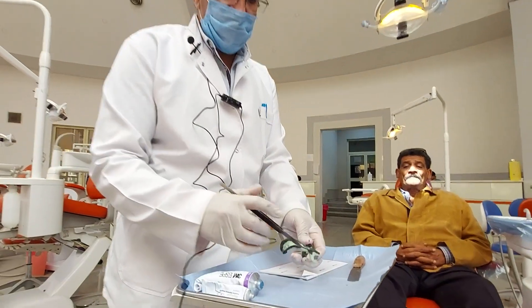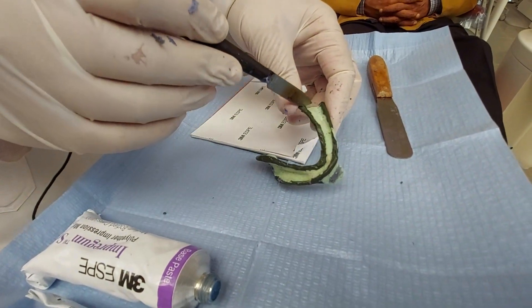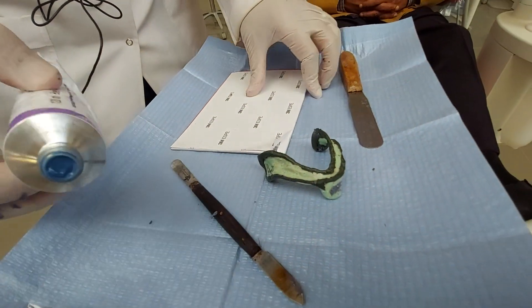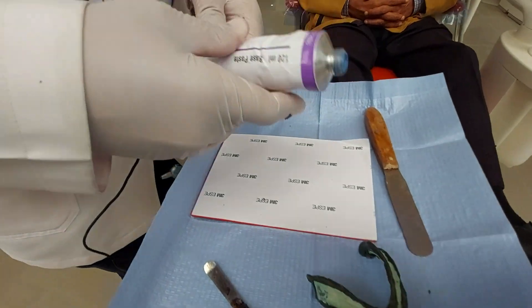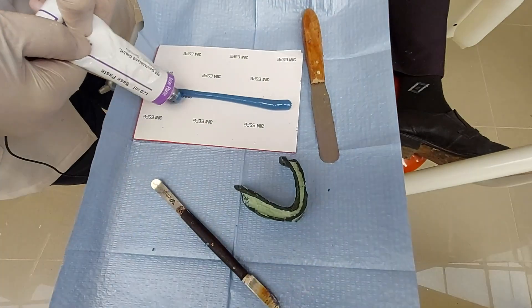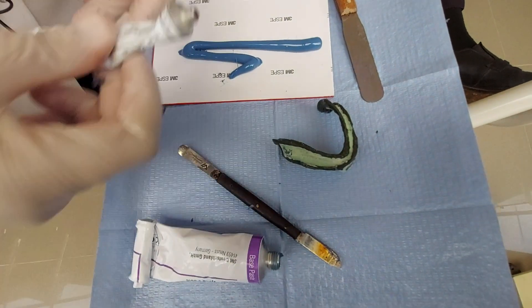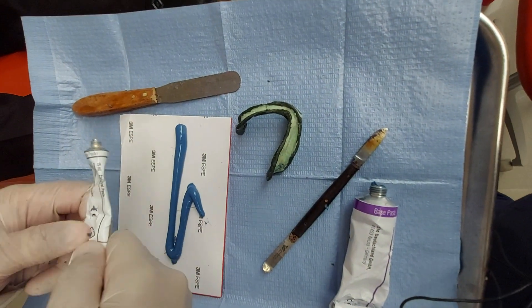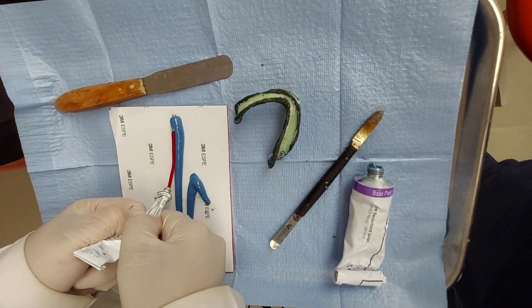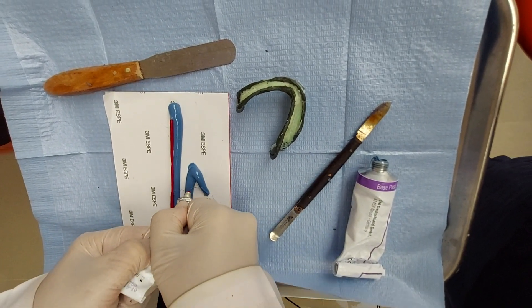After scraping the impression to remove all the excess material that comes into the tray, so that only two millimeters of the green stick is present all over the tray, I will use the rubber base to take the impression. For the lower arch I have to apply one and a half amount from the base and equal amount from the catalyst. The material should be equal in amount so that to do a proper reaction and have a proper impression.